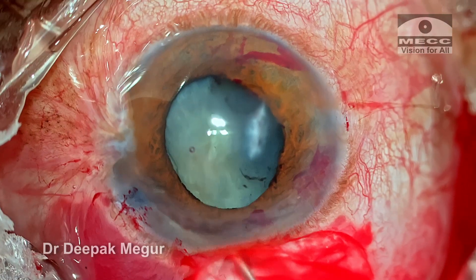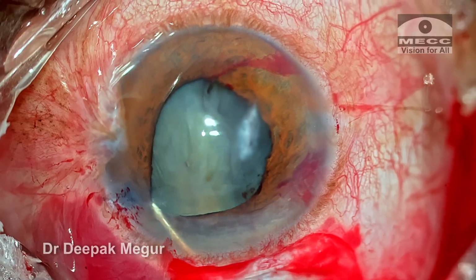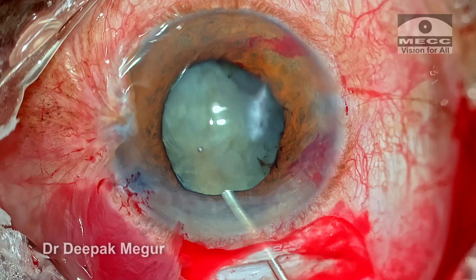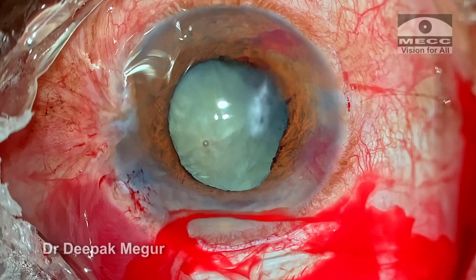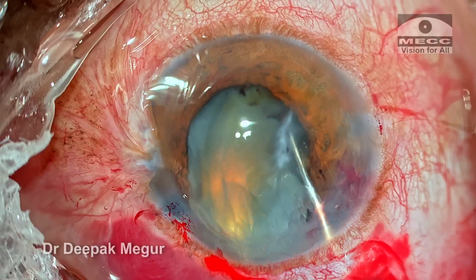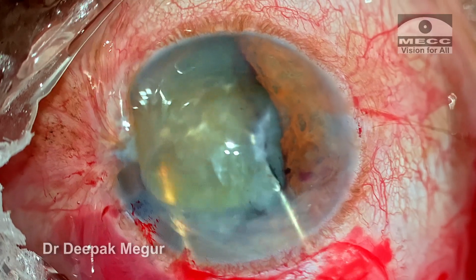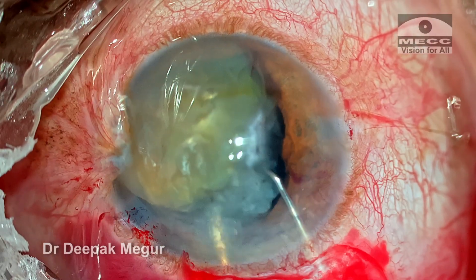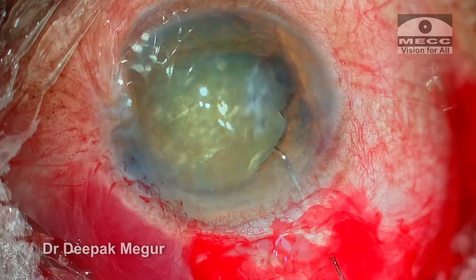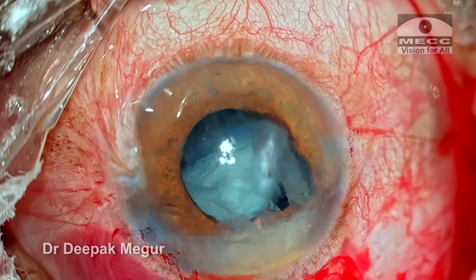And I'm avoiding any hydrodissection because in a case of a discontinuous rhexis and a potential pre-existing PC tear, hydrodissection can do more harm than good. It can bloat the posterior capsule. There's a reason I avoided it. I just nudged it, and I'm going to use 2 Sinskey hooks to wheel the nucleus out of the bag. The nucleus is easily wheeled out of the bag, and then I'm going to use a phaco sandwich technique to capture the nucleus in between these two instruments and then pull it out.